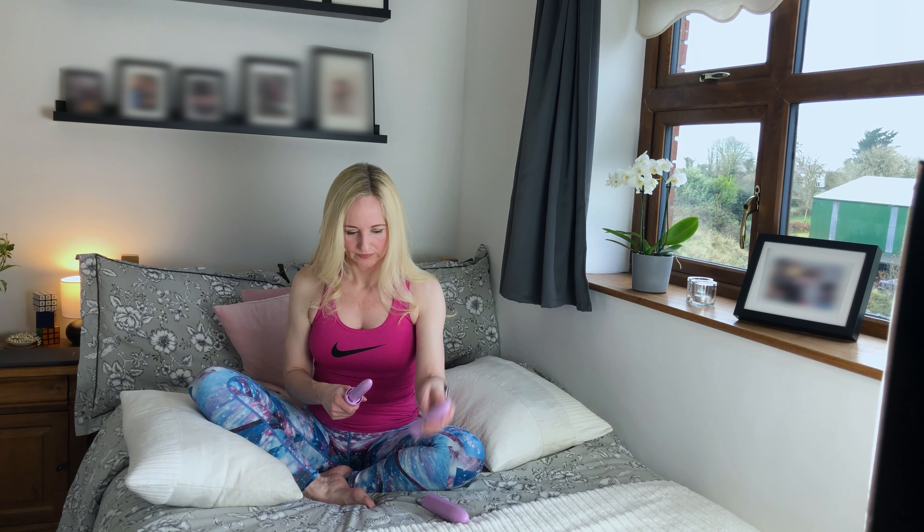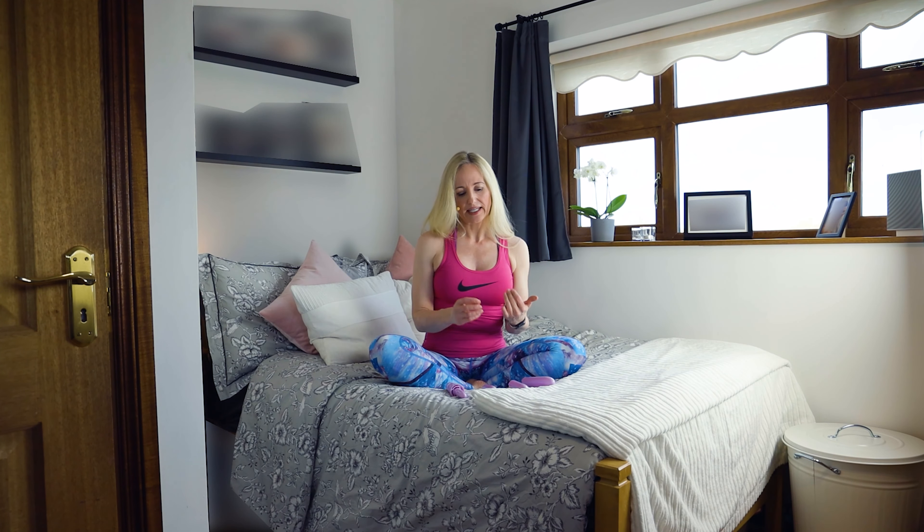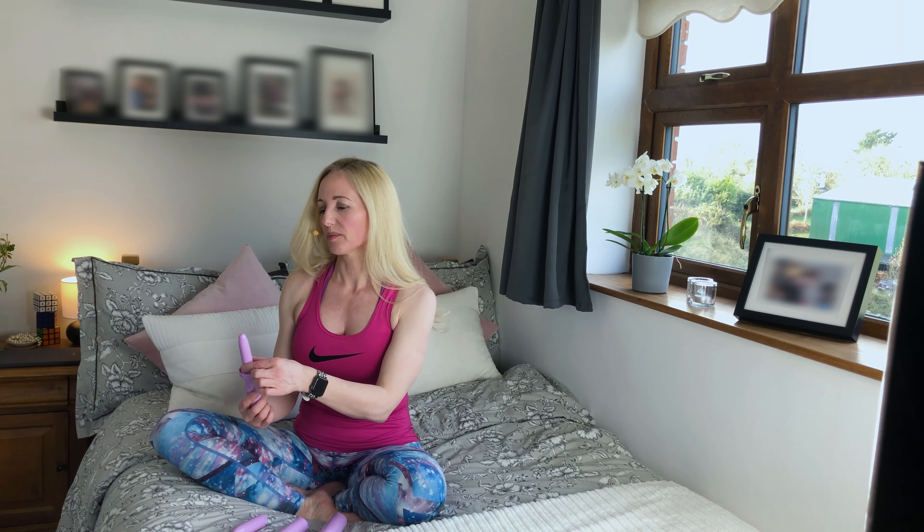I've been getting lots of requests about how to use dilators to overcome vaginismus. I have a little set of dilators — they're a bit like Russian dolls. I bought these back in 2013 after a perineal repair surgery. That's quite a large starter. It is possible to get a range of dilators with a much more varied size scale, so that you don't have to start with something this big. I'm going to go through some of the things you can do to relax in order to use the dilators and achieve a successful opening.